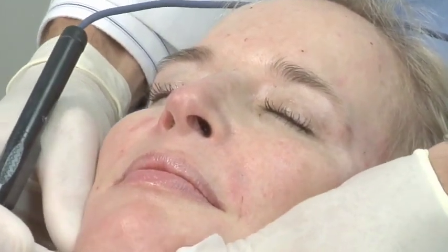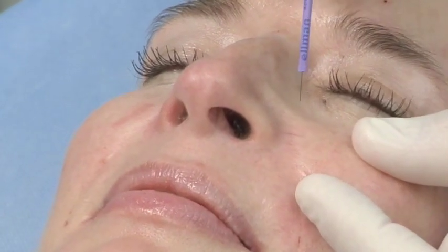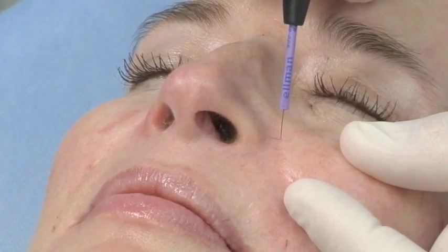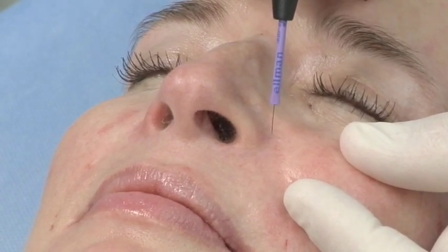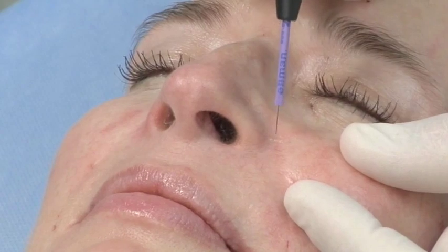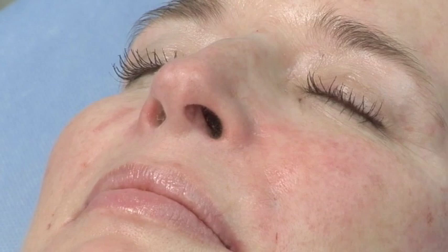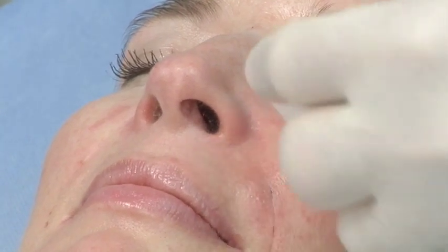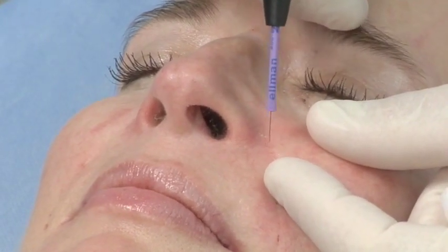It really doesn't add anything to any minor recovery time. In fact, Robin will be going out later tonight. We're just going to tap out this little bigger spider vein — little telangiectasia there. It does smart a little bit, but they really seem to tolerate it pretty well. Can you see that? It really has disappeared very nicely. Just a little time and patience — that's really done very well.